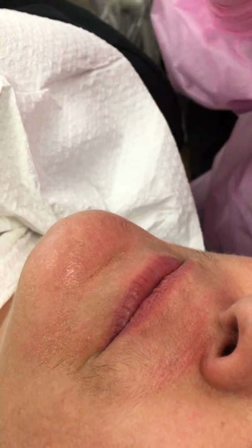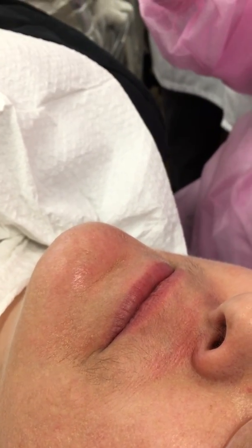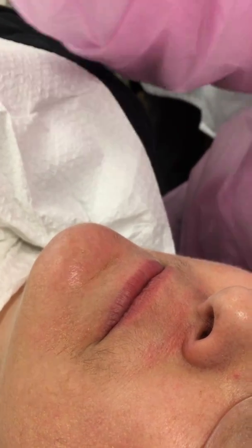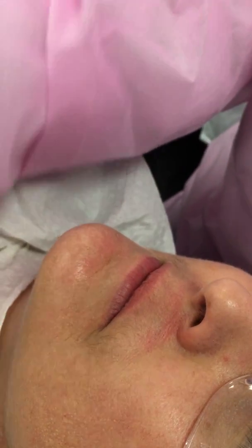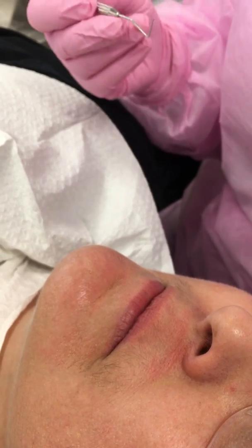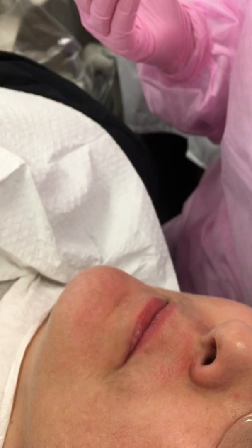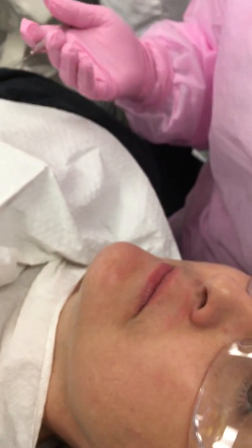Now, when we're probing, we're going to begin on one side of the arch and work across to the other side. We're not going to work in areas 1, 2, 3, 4, 5, 6 like we did for scaling. I have my own way of probing, so you're going to figure out which way you like to do it.